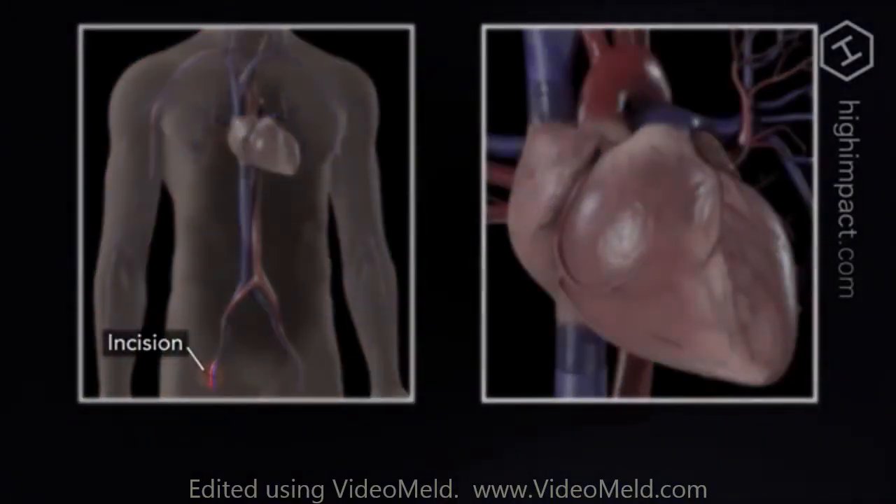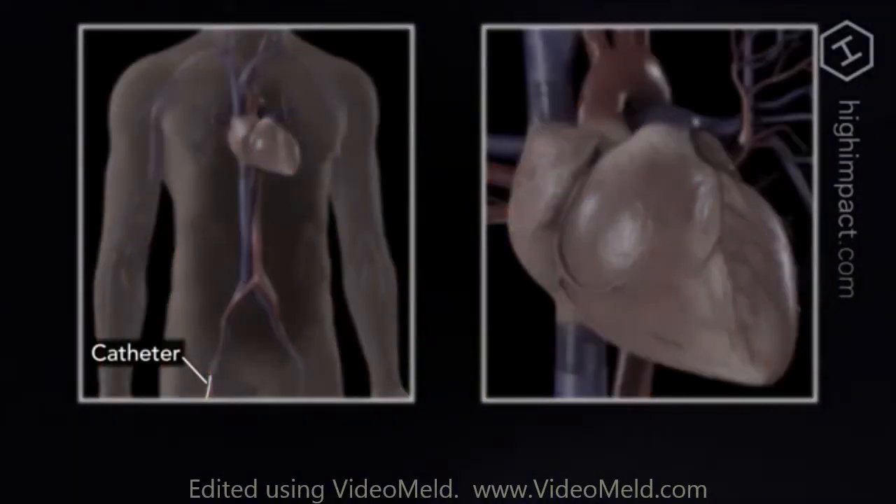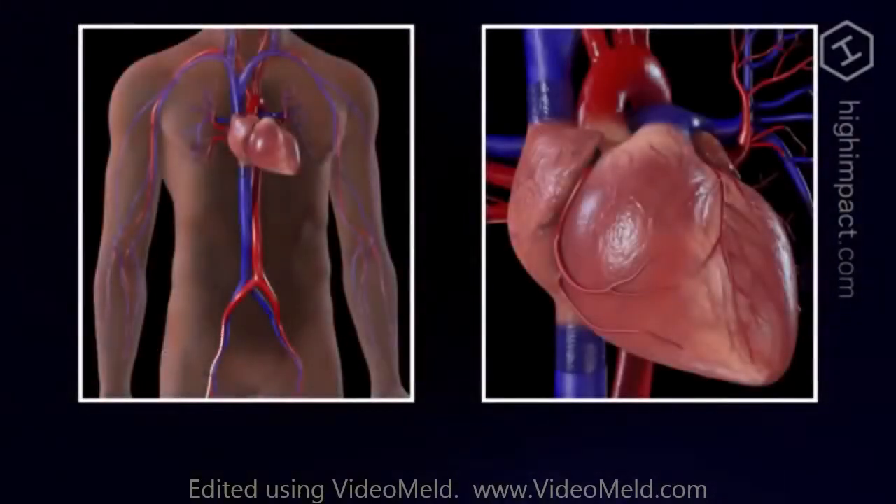At this point, you will be given a blood thinner to reduce the risk of blood clots. Next, a soft, flexible catheter is slipped over the wire and threaded up to the heart.